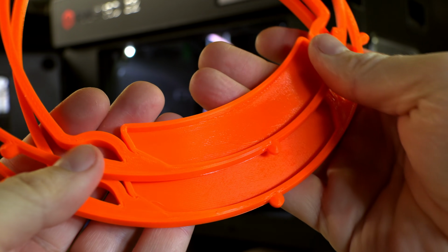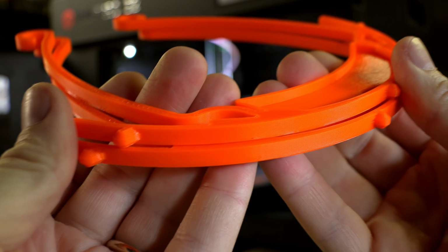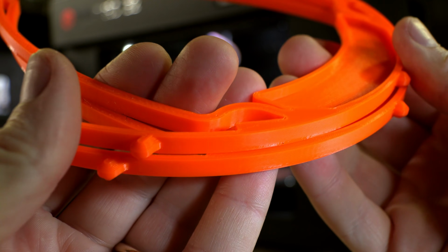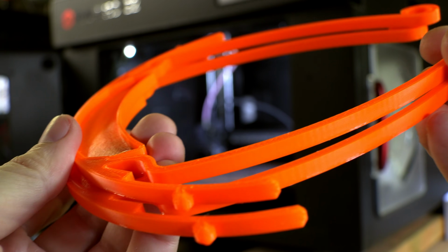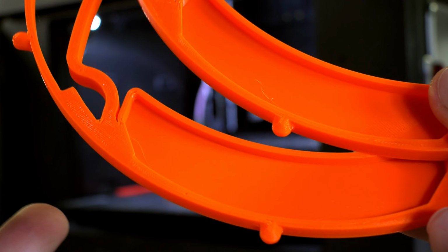The orange Prusament looks pretty good on camera, and the Raise3D E2 did a wonderful job printing this out. 0.3 millimeter layers look fantastic in this filament, and the machine performed beautifully. These are good. Let's put these with the others and let's wrap this up.